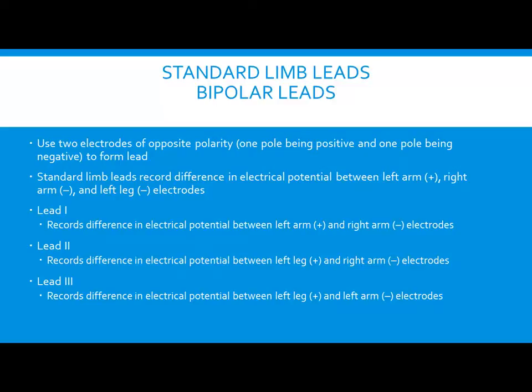On the top of that, where it says standard limb leads, should that left leg be the positive electrode? Because the left leg's negative up there, but the left leg's positive down here. Yeah, it changes. The left leg changes polarity. Up top it says left leg negative. Okay, so yeah, for these three, it's going to be positive right there. So yeah, you're right.